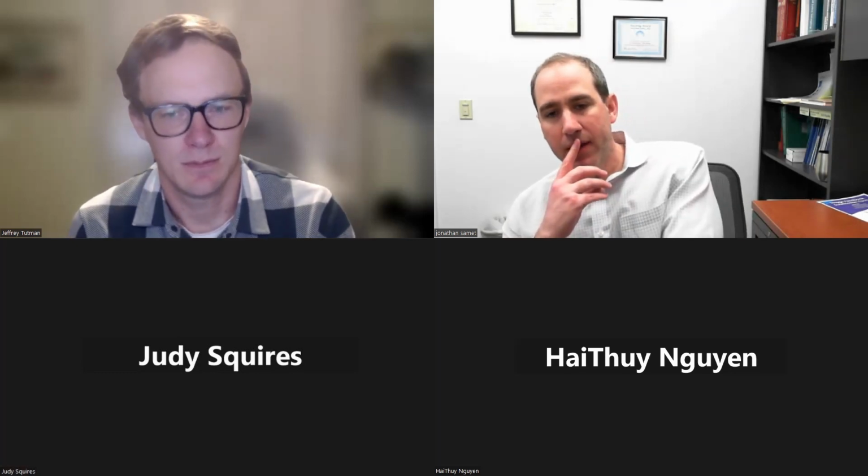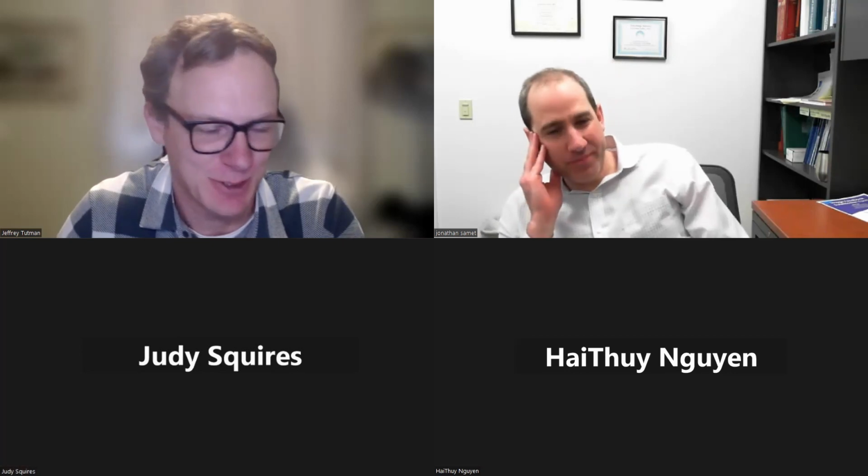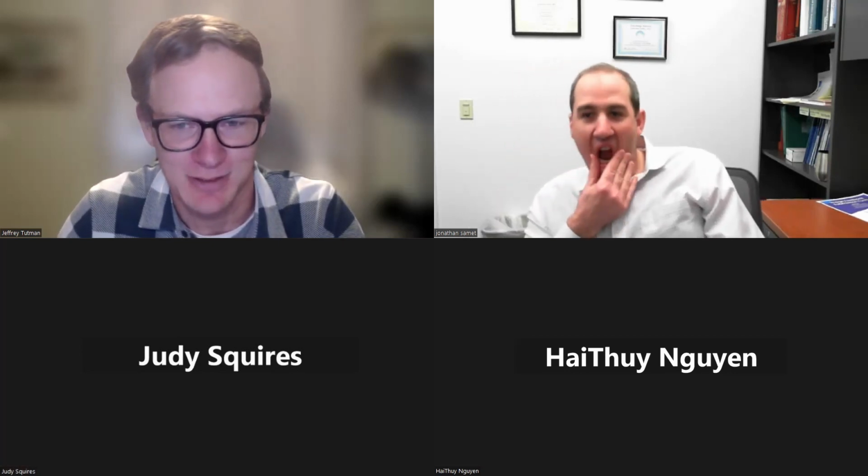In a case we had recently, we didn't necessarily see a slip, but we said, hey, if you have pain there, our IR guys offered a nerve block. So I just went up the day of and showed them which rib and the area and things like that. Yeah, we've done a couple of those too. And there's a really nice video on YouTube, somebody presented it at AIUM and then it got uploaded to YouTube, that I always rewatch. It has really nice images and a perfect description of how to do it. So that'll be a good reference if you want to learn a little more about what it looks like and how to do it. Sure.